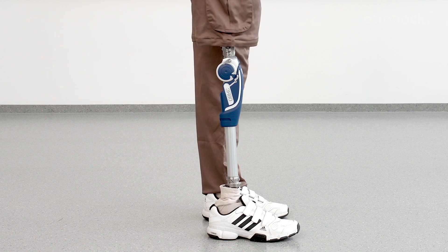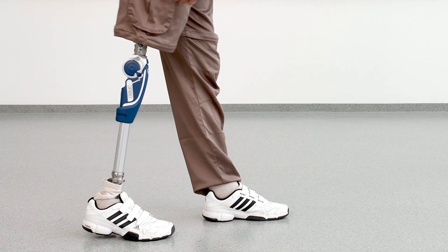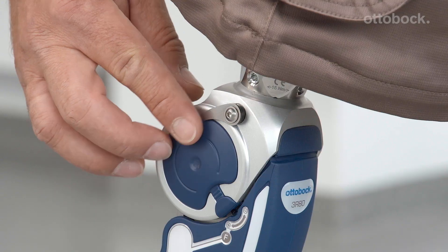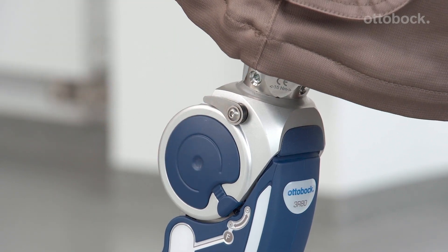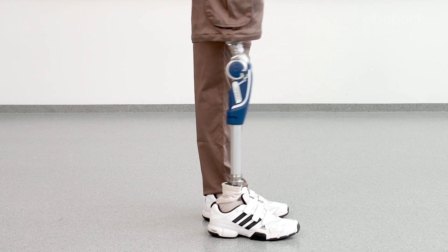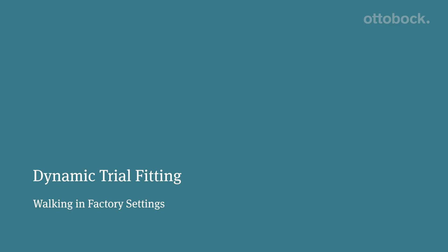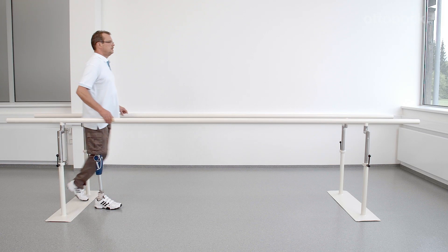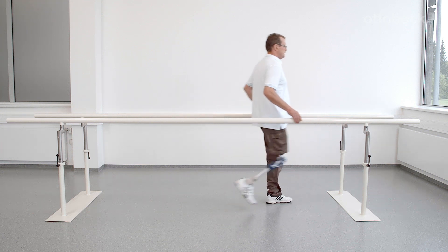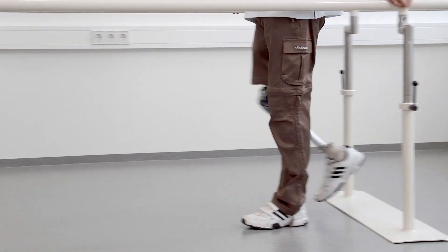The flexion and extension damping should both be turned to a minimum damping. Before the user can perform the first walking exercises, it is important to disengage the manual lock. To do so, the knee has to be brought to full extension under load. To get a first impression of the knee joint's swing phase control, let the user walk in the parallel bars with the factory setting.